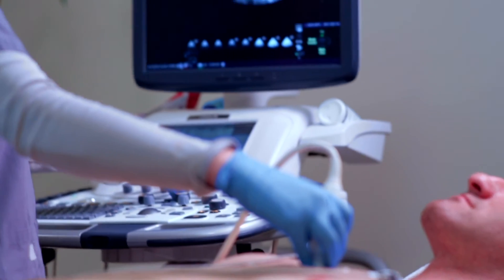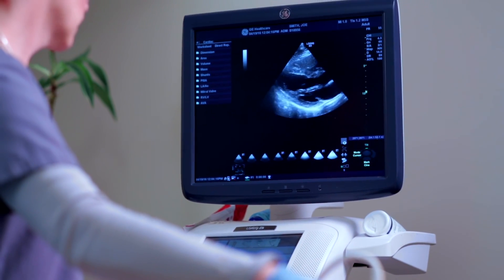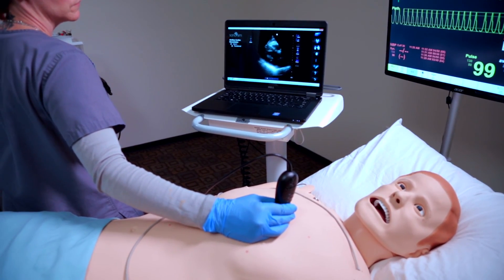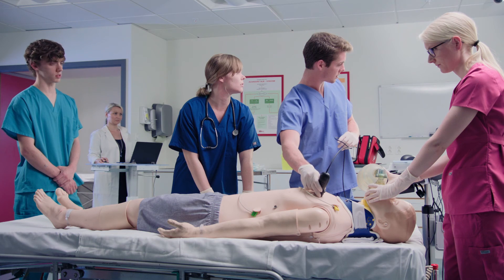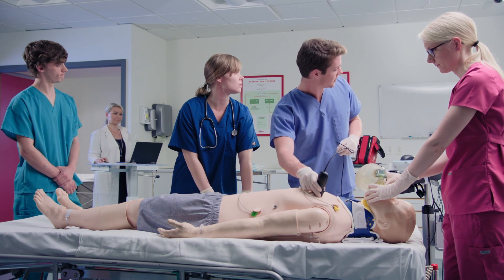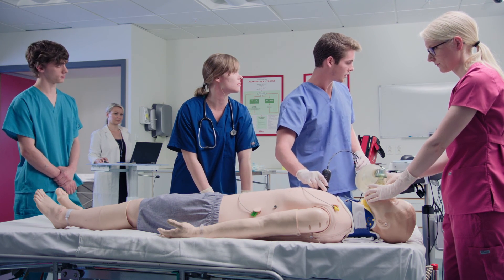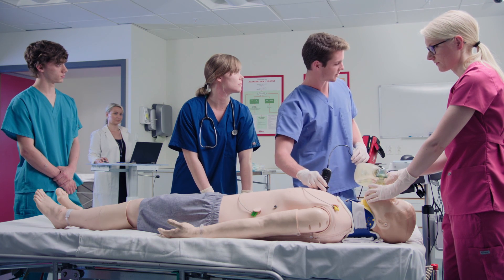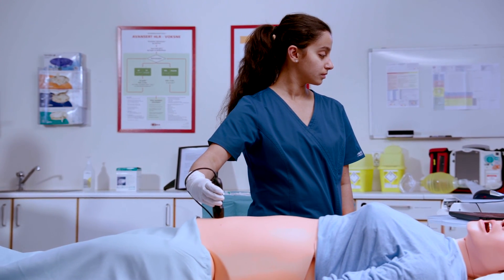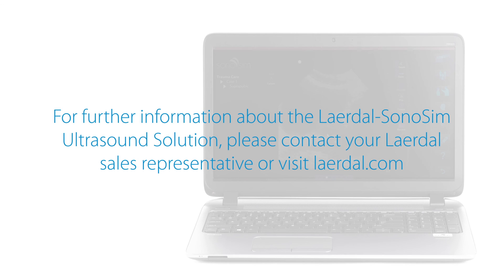Only the Lairdahl Sonosim Ultrasound Solution combines real-world patient care simulation with learner-operated, realistic, point-of-care ultrasound assessment of complex patients. Its scenarios deal with challenging but commonly encountered clinical cases where the correct application of bedside ultrasound acts as a pivot to facilitate timely medical intervention and decision-making in a risk-free environment. Simulations that don't include ultrasound aren't replicating real life. The Lairdahl Sonosim Ultrasound Solution offers the most comprehensive simulation training to prepare learners for real clinical practice. For further information, please contact your Lairdahl Sales Representative or visit Lairdahl.com.